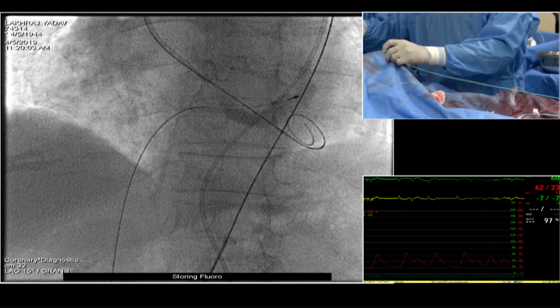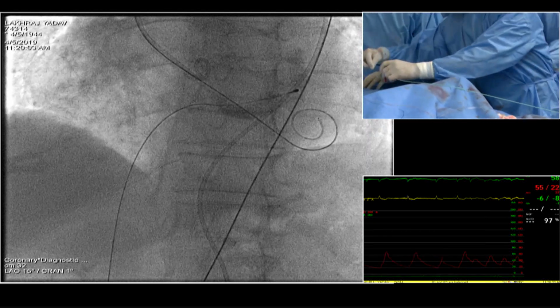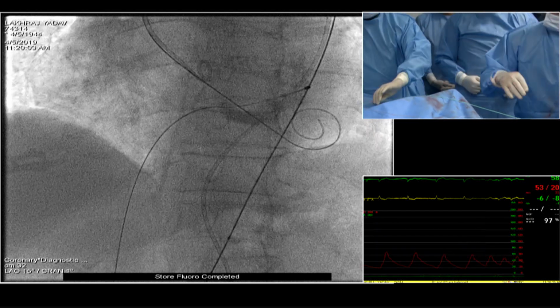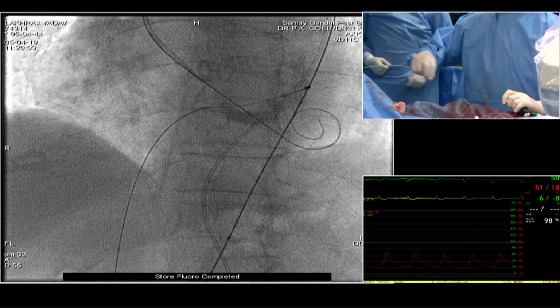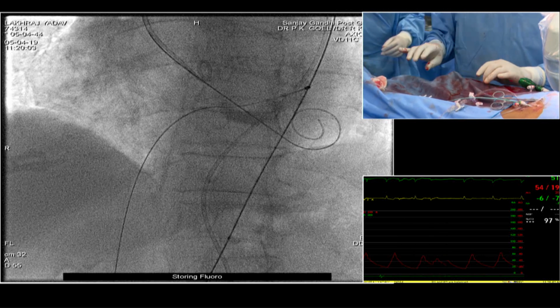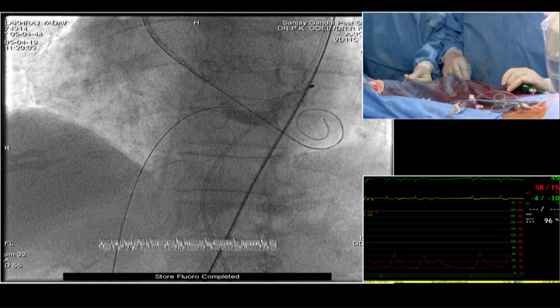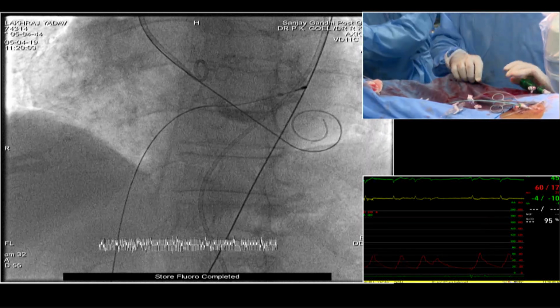What about the access? Do you use ultrasound or just angio-guided? Angio-guided. We have done the angio as I showed you. Does the annulus calcium, or the oblong aortic valve, have any bearing in choosing your valve? Just a second. I think some pressure has to go up.